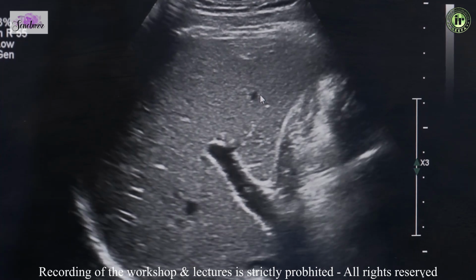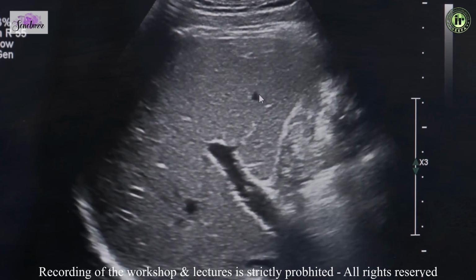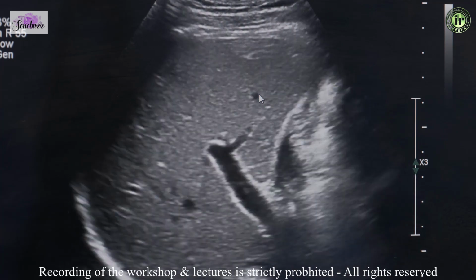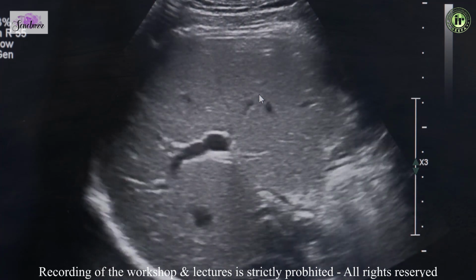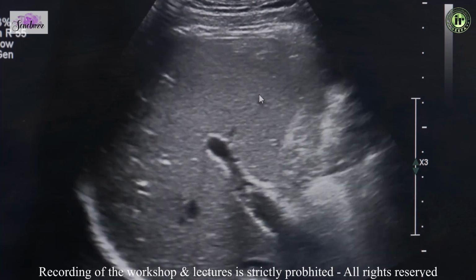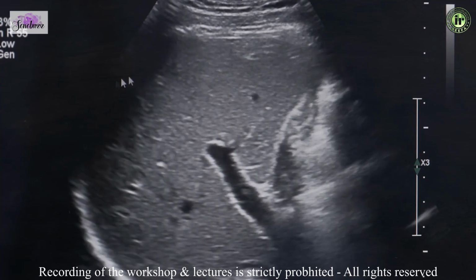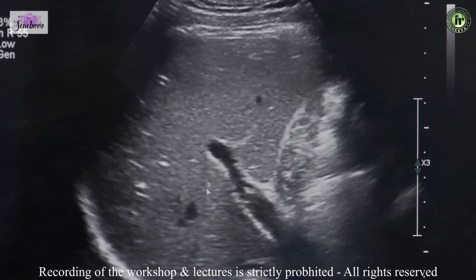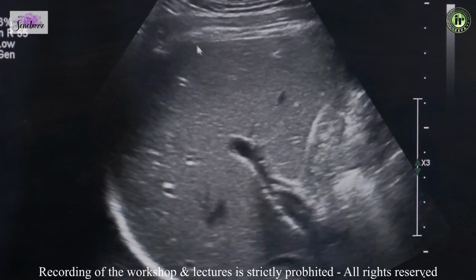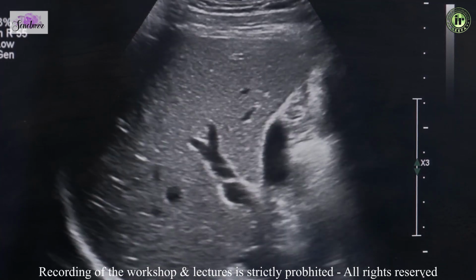Now, one of the common questions is, where do we take the readings, in which segment? As per the SRU guidelines that we follow, the readings can be taken anywhere in segment 5, 7 or 8. The thing that you really need to avoid is the left lobe of the liver, because this is where the cardiac pulsations are going to pop up, and we do not want this to hamper our reading. So the left lobe is a big no-no, but the right lobe, segments 5, 7 and 8, is absolutely fine. You also do not want to be too close to the gallbladder or too close to the diaphragm, because this can alter your readings completely.